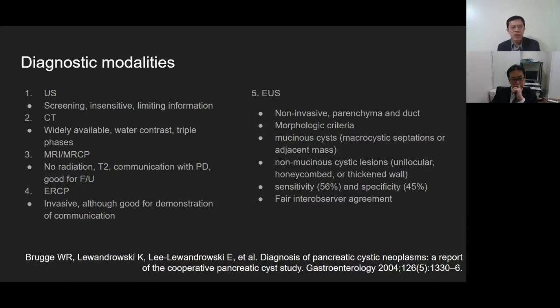For ERCP, for diagnosing pancreatic cyst, at the very least in my practice in Thailand, and I think in most countries in the world, we don't often use ERCP for evaluation of the pancreatic cyst, more like in the past. But in Japan, I heard that they still use it in some cases, particularly small cysts that might be difficult to do the FNA.